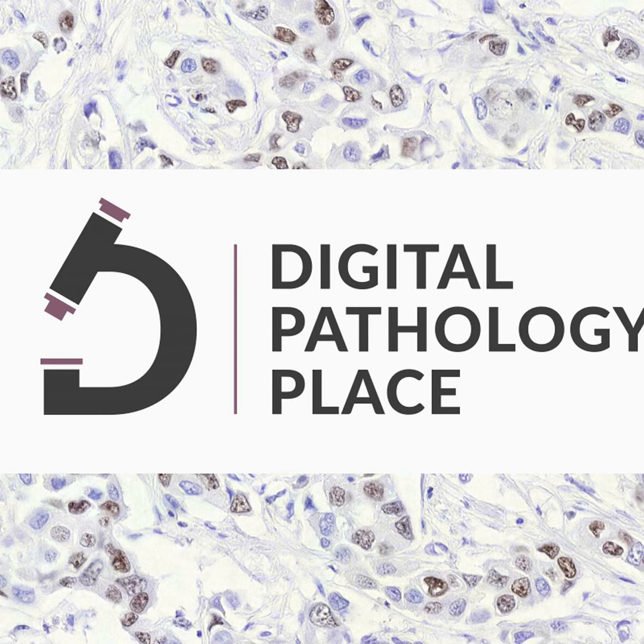At the same time, he would like to know what the pattern over time of his lab is. So for example, in the beginning of the month, when you have new stains, maybe those stains stain more darkly. As you get towards the end of the month, maybe those stains have started to oxidize, they don't stain as well.